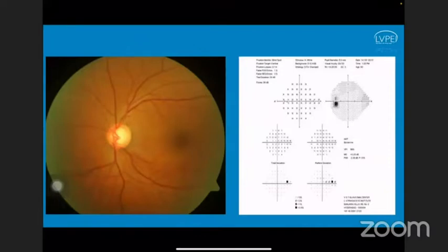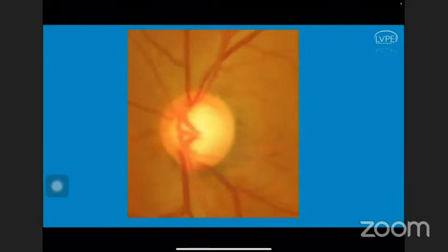Now, this is the visual field on the right-hand side and the optic disc on the left side, not visible clearly. So we will try to zoom in. And if we had to draw a diagram on this, we can easily draw. I'll just go backward and forward so that I can just focus on what I'm showing here. What you can clearly see here is an excavation along the neuroretinal rim and an oval-shaped cup. So we typically just mark the cup with a hash kind of a thing, and excavation as shown here with the dots.